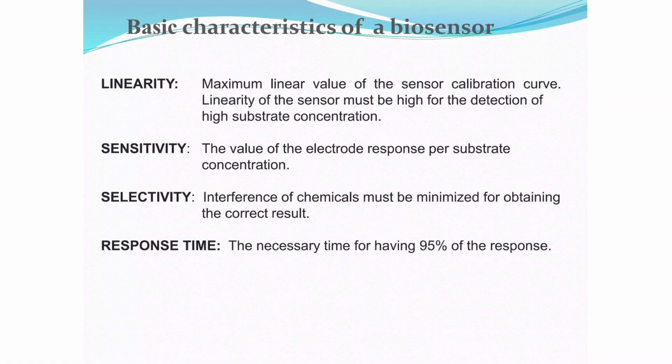And here the attention is on the glucose biosensor. Glucose monitoring is the most widespread and commercially successful application of biosensor technology. It is used in clinical management where patients must track their blood sugar levels multiple times a day to avoid acute or chronic complications. The development of these highly accurate systems has transformed diabetic care from complex laboratory procedures to simple, painless self-monitoring at home itself.